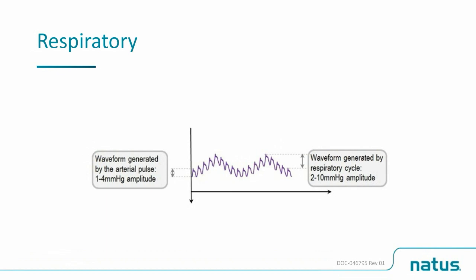These changes in thoracic pressure can directly affect your ICP value as well. 80% of the blood in our cranium is venous, and we depend on this venous drainage to maintain a normal ICP. When a patient is apneic, they're decreasing venous drainage and they can have a spike in ICP value while they're having an apneic episode.